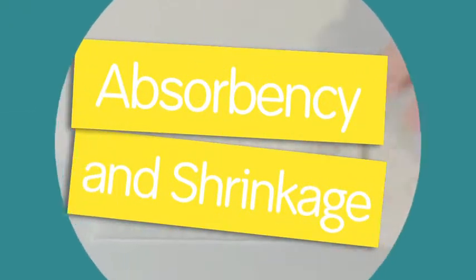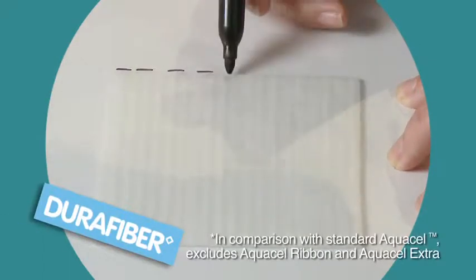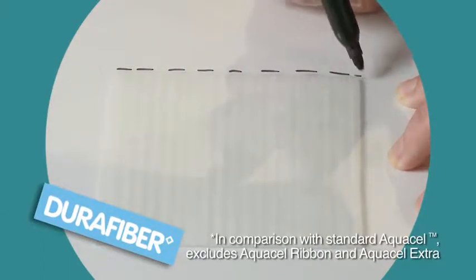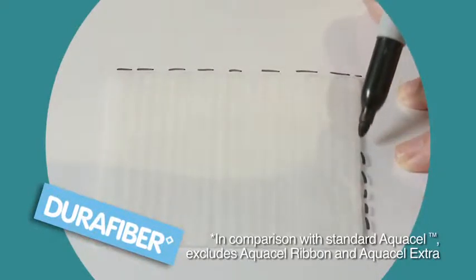DuraFibre's unique dressing composition means that it offers 30% greater absorption and over 43% less dressing shrinkage when gelled, compared to standard Aquacel dressings.